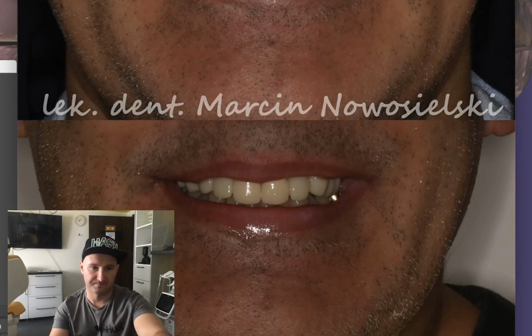So I think with this video I helped you to understand how to perform an intraoral scan the correct way, and I hope it will be helpful for you.